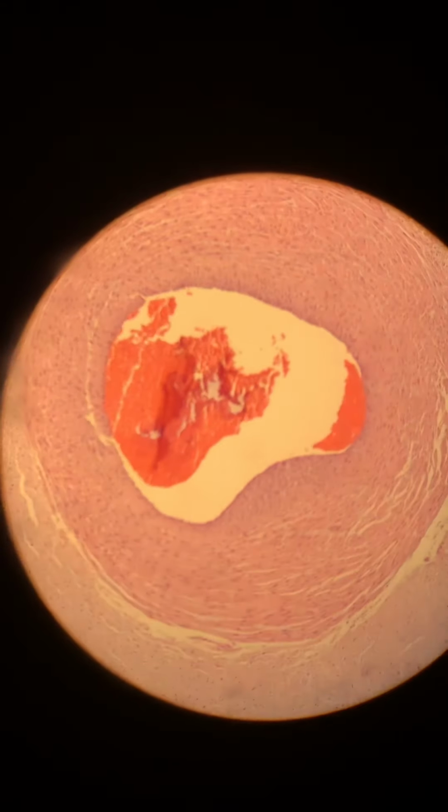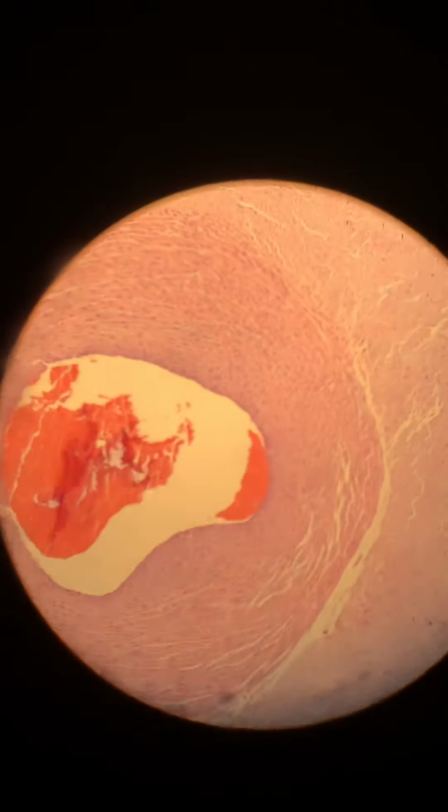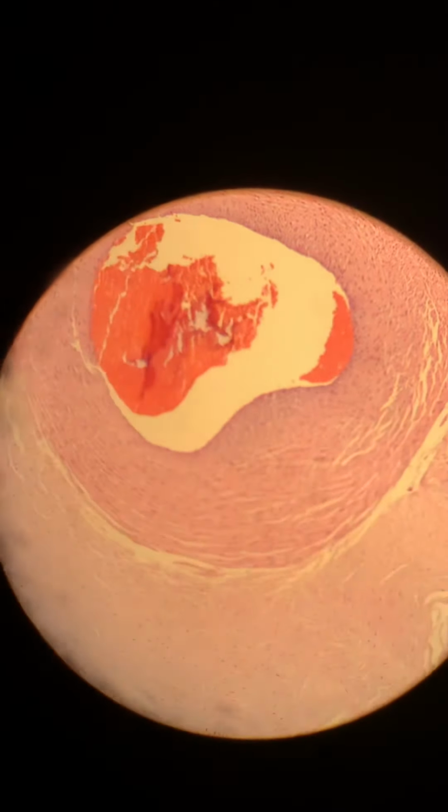As I scan around, there is one vessel. There's the second vessel. And there's the third vessel. And you can see all three vessels are very normal, without evidence of inflammation. Okay, so that's part one. We're going to go to the next slide.